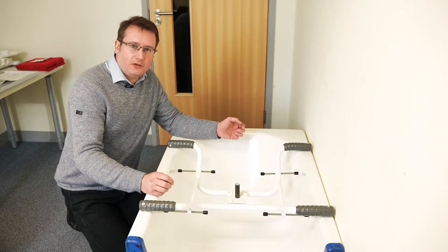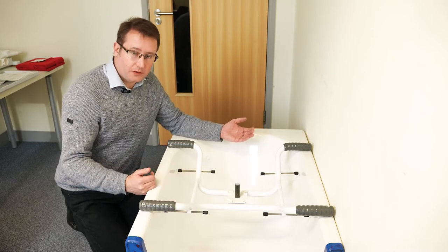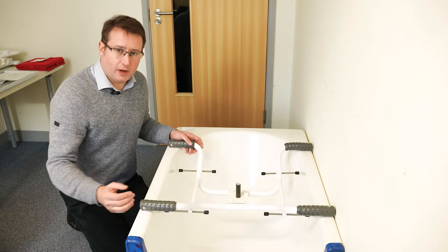Out of the box, the Ultra Swivel Bather is set up to be 26 inches wide. It can be adjusted in width to suit wider baths up to 30 inches, simply by turning the grey end cap rubbers — they will then screw outwards to accommodate the wider bath.